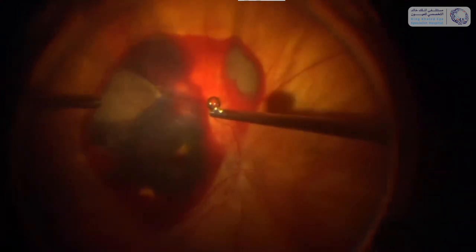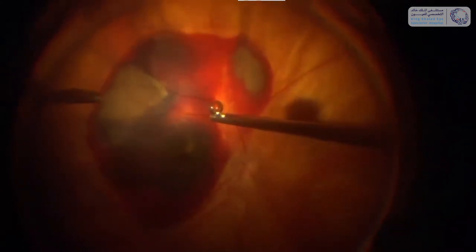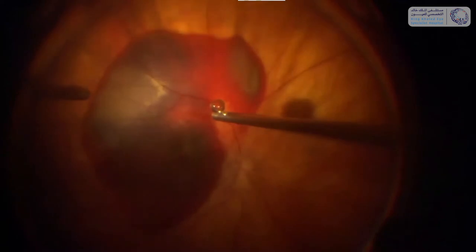In the syringe is not silicone oil but a solution of TPA, and I'm injecting this TPA solution through the retina with this 41 gauge needle. It's a very small hole we make in the retina so it will seal afterwards.